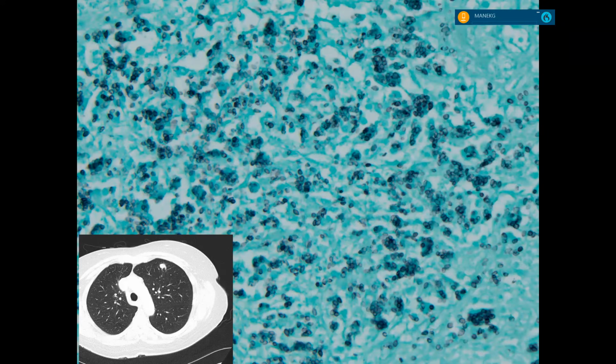If you're trying to figure out the differential of a fungal yeast, then size is the most important thing, and how the thing buds is also important. The smallest yeast that you could find is histoplasma, so a size like this is good for histoplasma. The shape also matters. If the yeasts are pretty much the same size, like in this case, that is good for histoplasma.